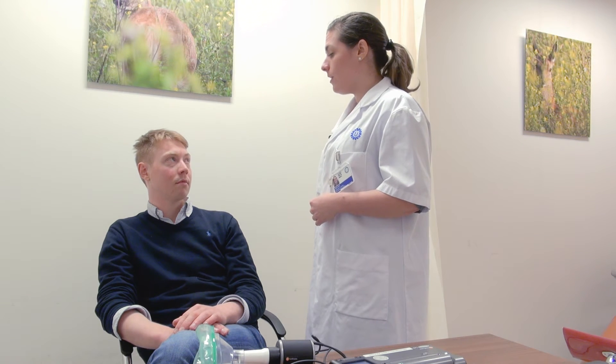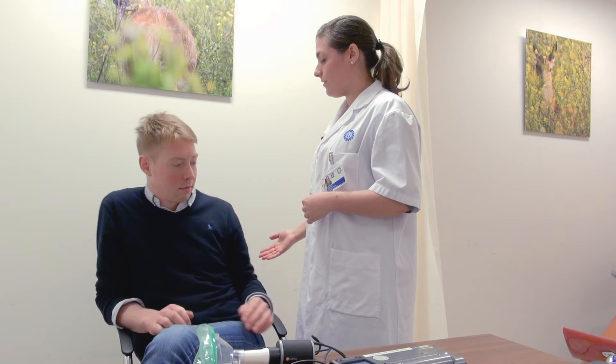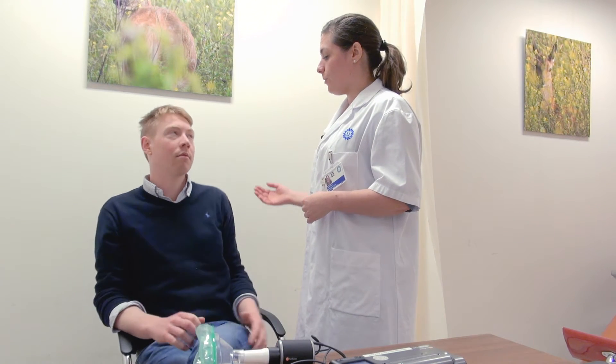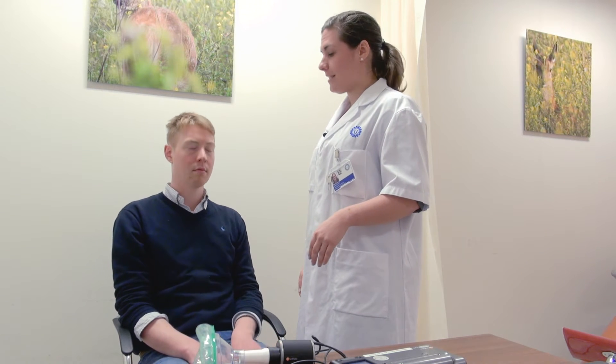Everyone has left the room now, so it's just the two of us. This way, you won't be distracted during the test. Your position during the test is extremely important. You need to be sitting up straight, with your back against the back of the chair. Your shoulders should be down and your eyes should be open. Place both of your feet on the floor and have your legs together.